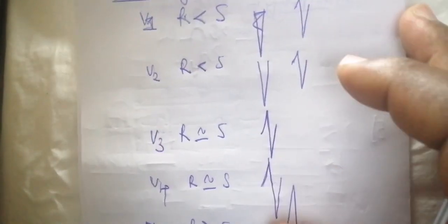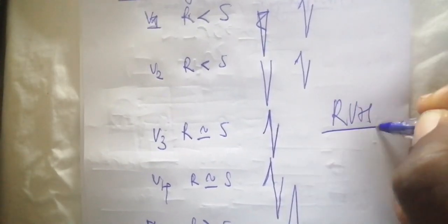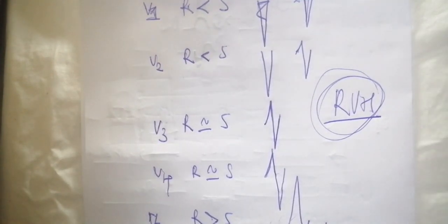Now you have to know that this helps you visualize if there is any right ventricular hypertrophy, because if there is an interchange of this complex, particularly when the R wave is greater than the S wave on V1 and V2, it is going to show you a right ventricular hypertrophy. So after the normal progression, the next element on the QRS complex is the axis deviation.